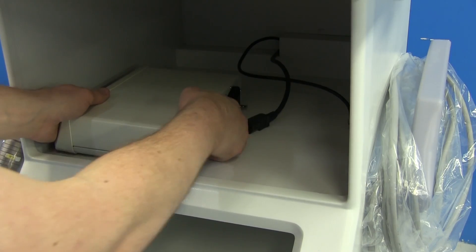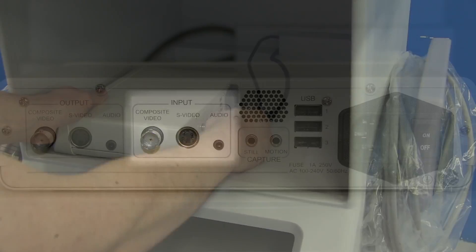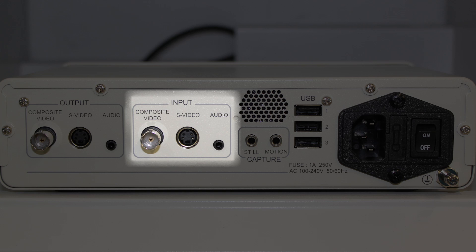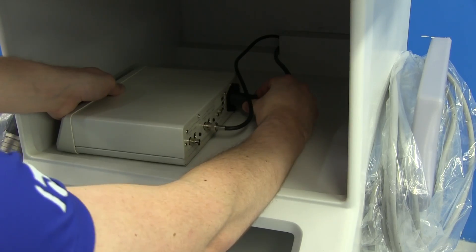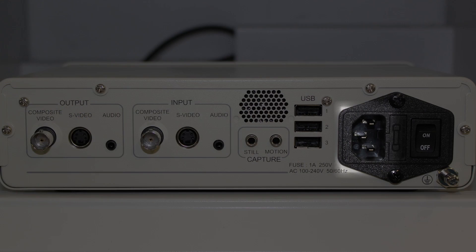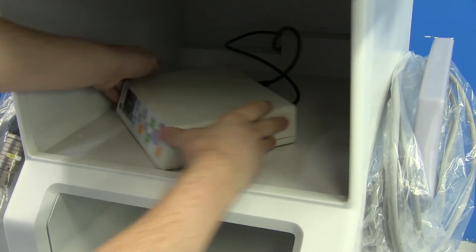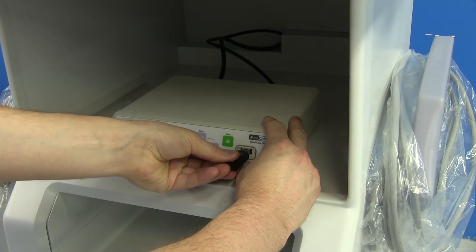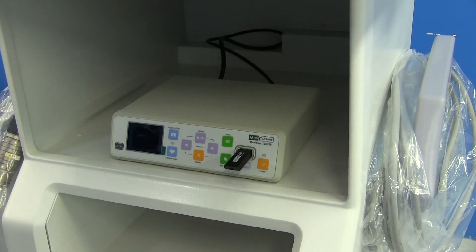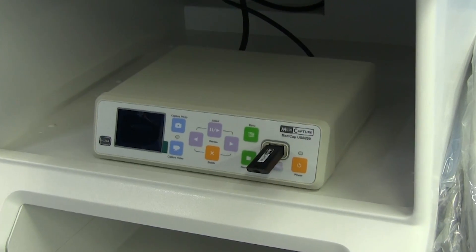In either case, you can take the provided video cable and plug it into the corresponding video input port on the back side of your MediCap. You can also take the end of the power cable and connect it to the three-prong port on the back side of the MediCap. Turn the MediCap around and insert the provided MediCap flash drive into the USB port on the front of the device. With that, your MediCap is connected to your C-Arm system.